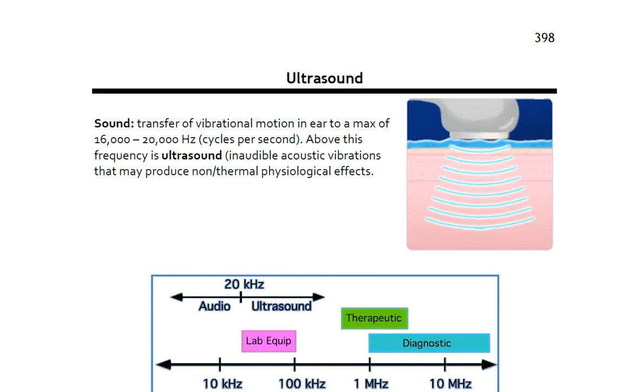Ultrasound, as you heard about before, and maybe you've seen last semester with Doppler ultrasound when doing the ankle brachial index, the ABI. It's a form of energy involving acoustics or sound energy and looking at how the energy emits from the transducer and it reflects into the tissue and it bounces back to create some type of reading or value. With that, there are a few terms to note with that.